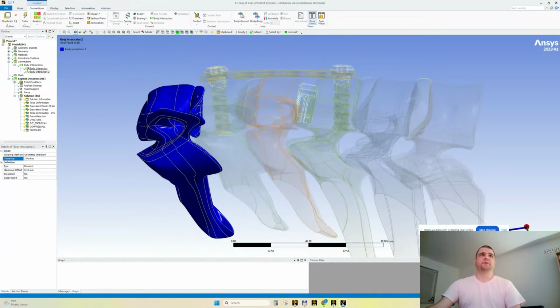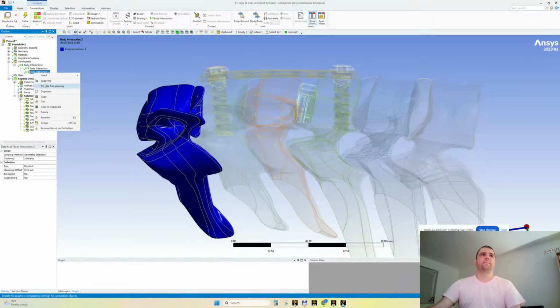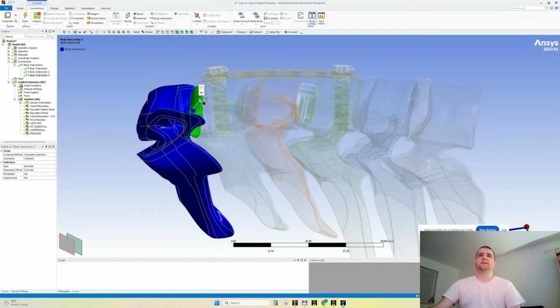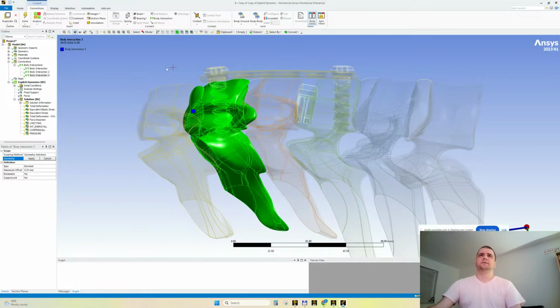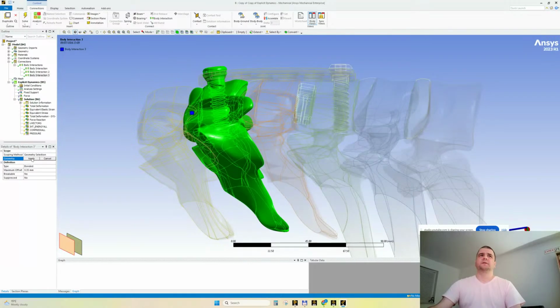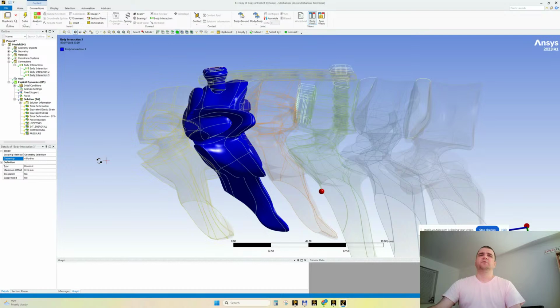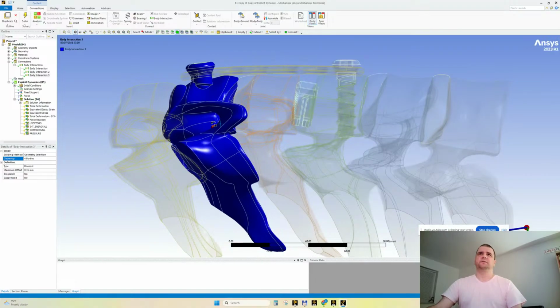So bonded. The next bonded pair is, let's duplicate, and I will select this and this. Let's deal now only with the spine and later with the screws, or let's add also the screws. We don't need pairs here. We don't need to think too much about the two sides, the so-called contact and target. No, we don't need to do this.